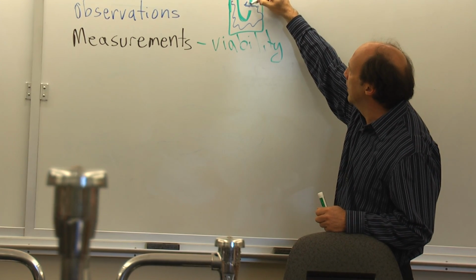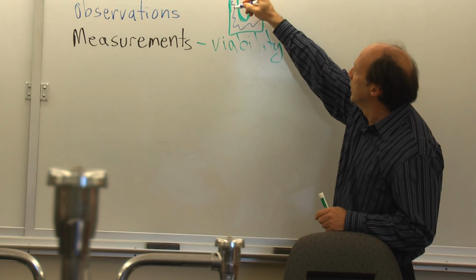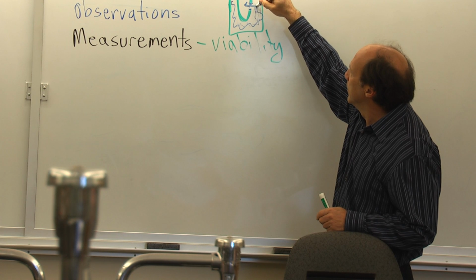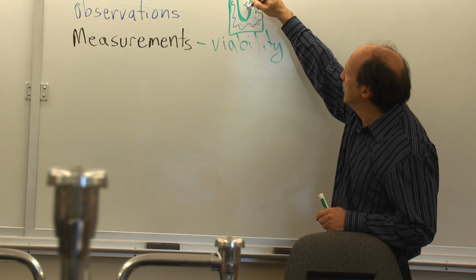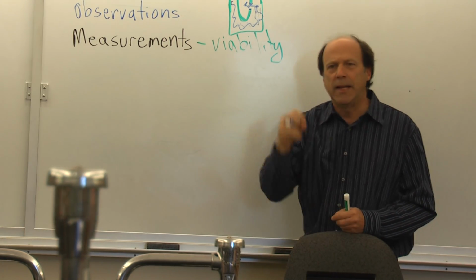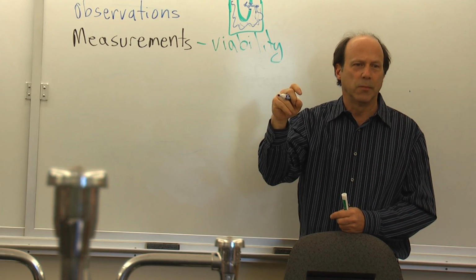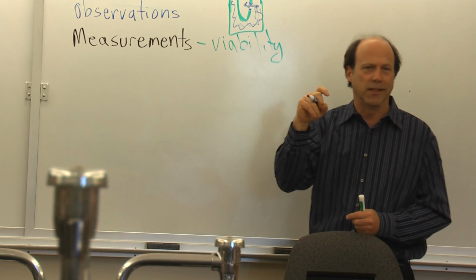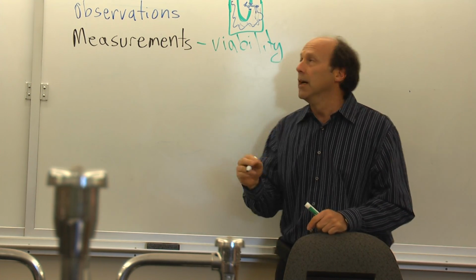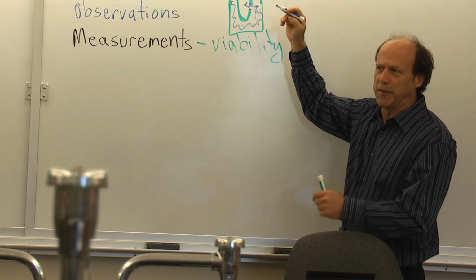The hole we could call the aperture, the tube we could call the probe. It's got a vacuum, vacuuming up some of this cell suspension, and it's going through this tiny pinhole. As each cell goes through, there's an electrical resistance, because cells are not conductors, they're insulators, because they have a lipid bilayer. So there'll be a momentary deflection in the electric field.